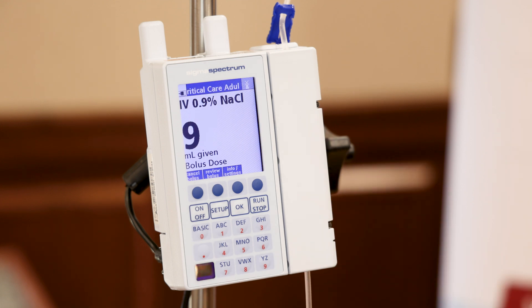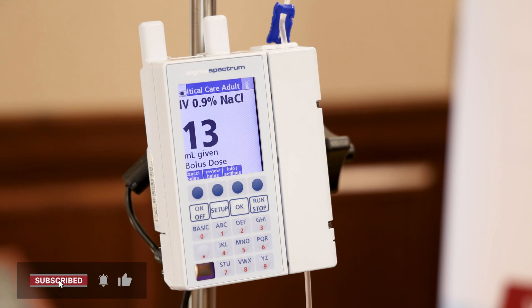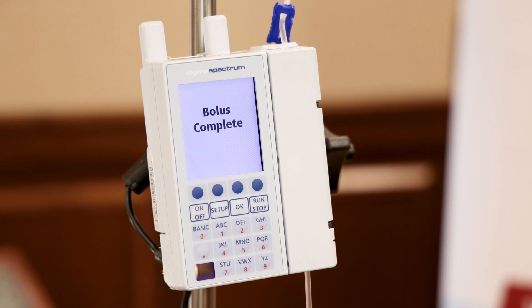You'll see it continue to count up to the 15 mLs I programmed. Once it reaches 15, it will automatically flip back over to the programmed rate of 75 that I initially started with. Bolus complete — we're back to the primary rate of 75.